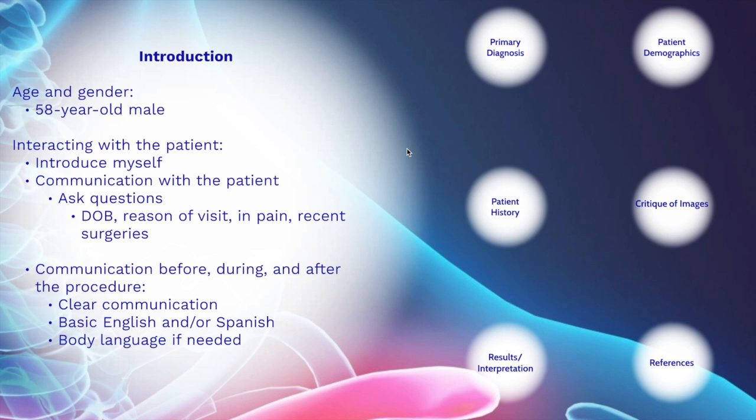During the procedure, I will instruct him how to be positioned and I will tell him to remain still so that I don't have to repeat the procedure and keep exposing him. After the procedure, I will inform him that his doctor will be receiving the results in 5 business days, and from there, he will get the results.